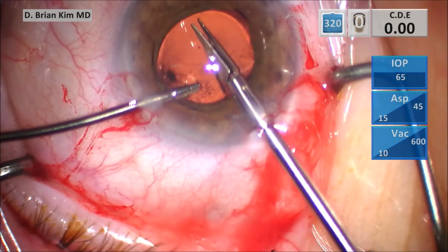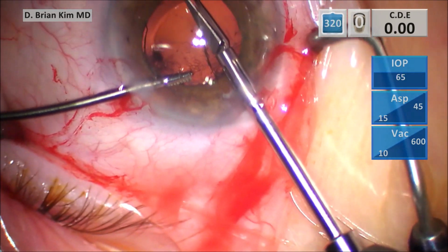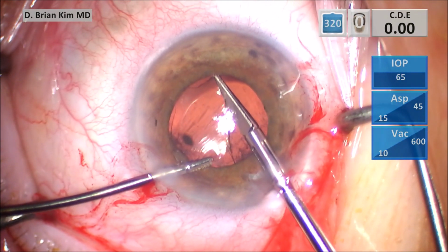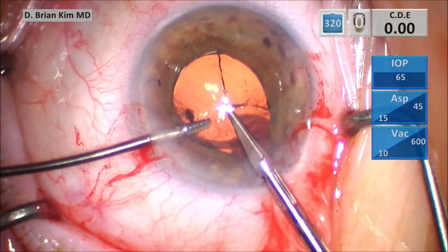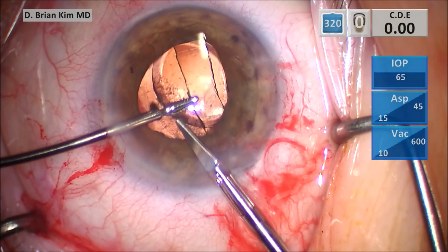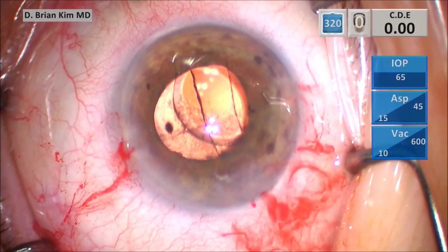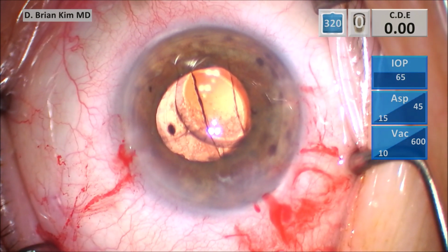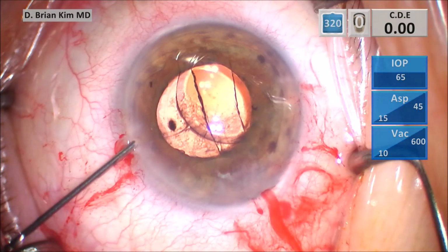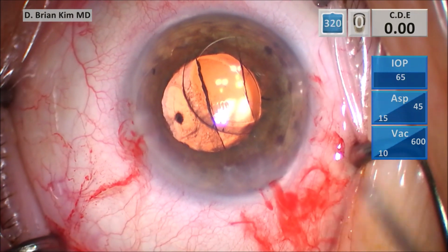with the scissors, being mindful, turning the teeth sideways and making sure I don't cut the posterior capsule as I cut the lens in half. Very carefully cutting the lens, being mindful of the position of my scissors, making sure I'm away from the capsule. Like I said, I pushed viscoelastic underneath the lens to push the posterior capsule back. I'm also protecting the cornea as I'm cutting the lens. So now I have two pieces. Push some more viscoelastic into the anterior chamber.